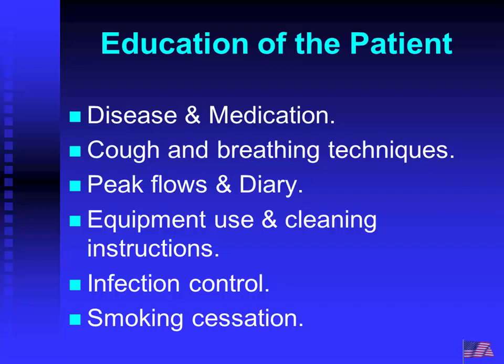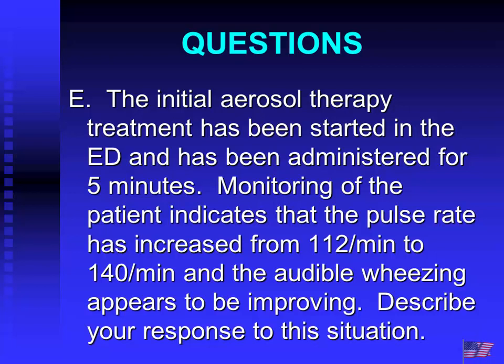If they're using peak flows, identify whether they've established a personal best, and whether they know what the red, yellow, and green of their traffic light means. Also cover cleaning of equipment, especially in the home, which is a little different, obviously. And if they're still smoking, try to get them into a cessation program.